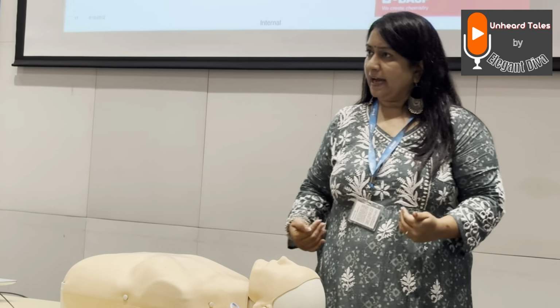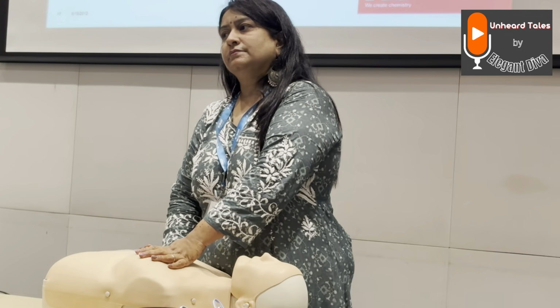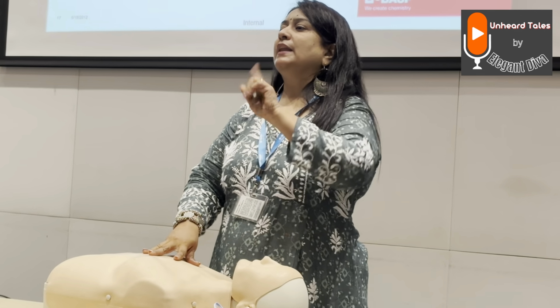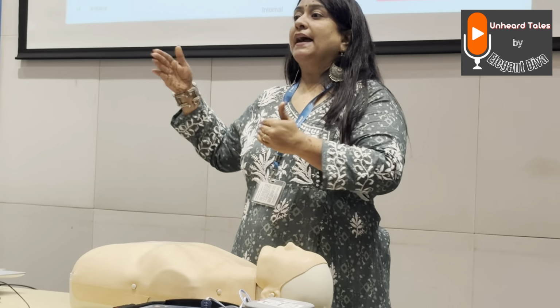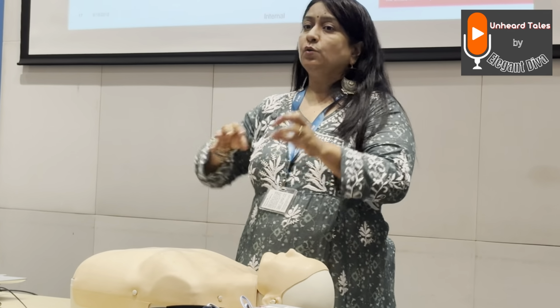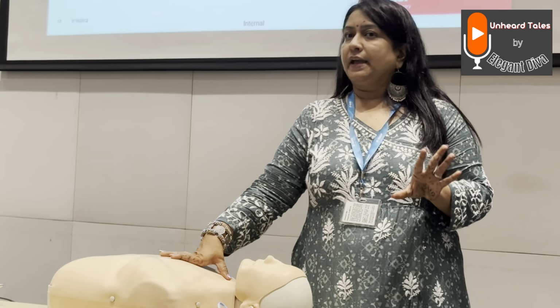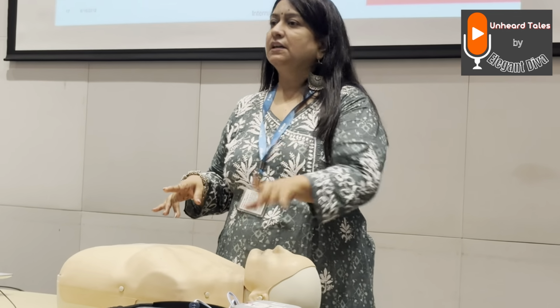Okay, so you have to move back, you have to press this shock button. Once you press that button, the shock is delivered. Like this, shock can be delivered at a stretch 3 times. Once the shock is delivered, again this machine will analyze whether the rhythm has come back or not. If not, then the device will tell you again shockable rhythm, or it will tell you continue CPR. If the rhythm is not shockable, it will tell you not shockable rhythm, continue CPR. So then you don't need to deliver a shock. Here you don't need to use your head at all. All instructions are given by the device.